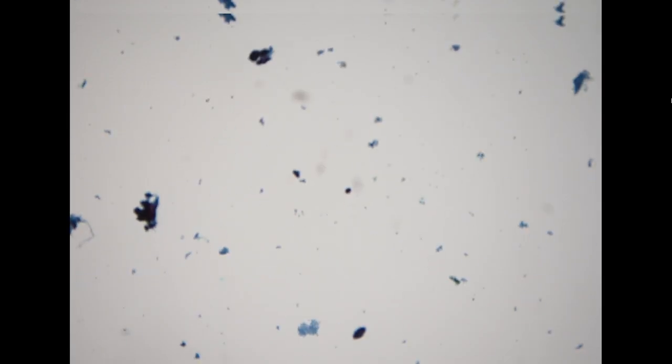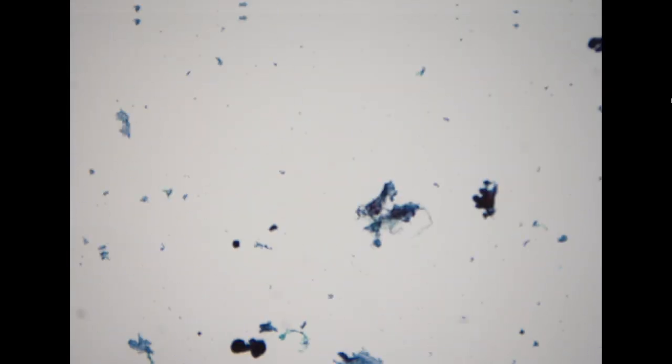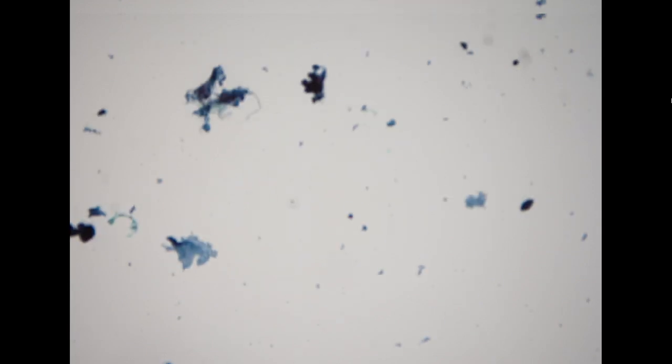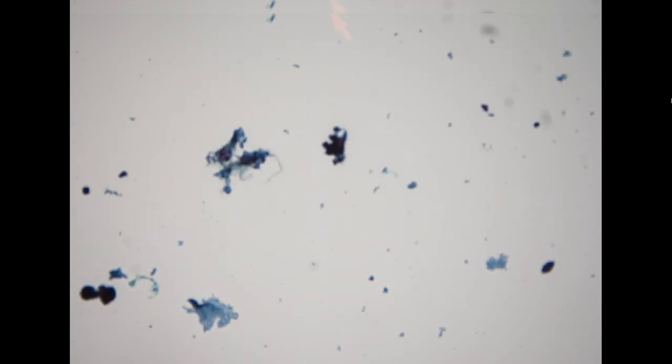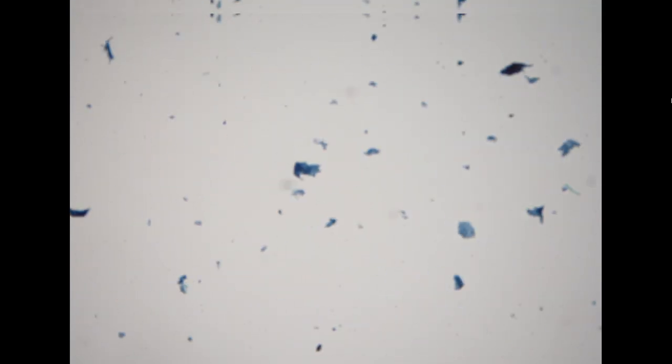So the next specimen is also a thyroid aspiration specimen. We've already been quite experienced with this type of specimen: low power, hypercellularity, but no colloid. And then we start to see some architectural pattern, some complex papillary structure, as well as monolayer sheets of flattened cells.